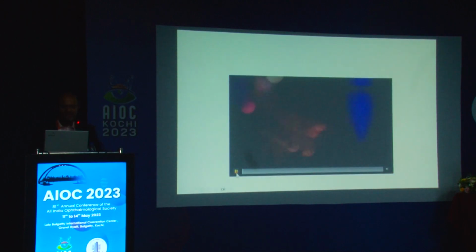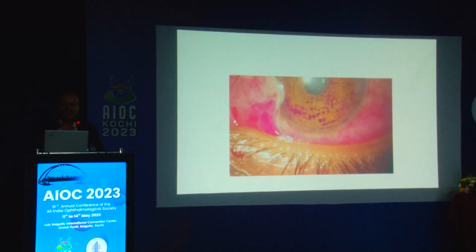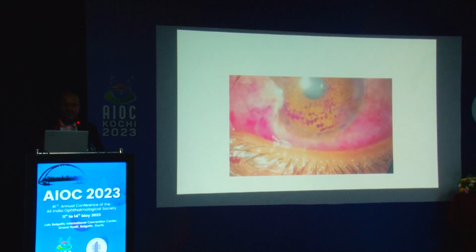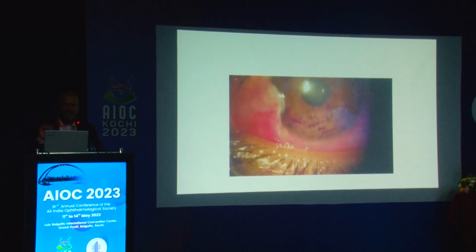And this is the same patient post-op day 1. You could see there is bleeding in the eye, blood clots, and you can see the vision is 6/6. The intraocular pressure is 10 millimeters of mercury, and the chamber is filled with viscoelastic. You can see the reacting pupil very nicely. So patients do very well. They don't have any sutures.